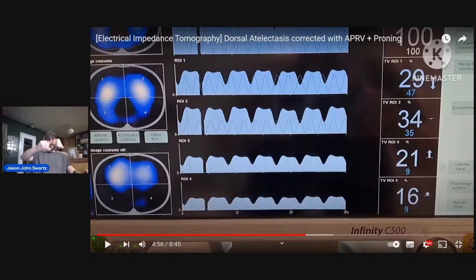Start looking at the inspiratory flow, and then let's say, go down by 2. And if you start seeing the amplitude on your inspiratory flow get larger and the volumes get larger, it tells you right away, oh, I was probably way too high, and now I've lowered it so the patient has some more inspiratory capacity to move. So once they do start breathing spontaneously, it gives you a lot more information.